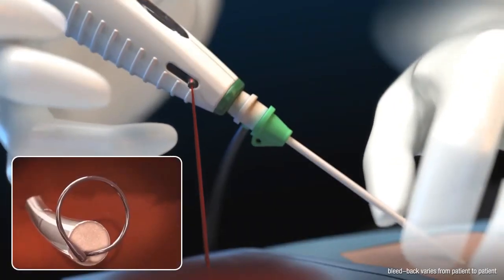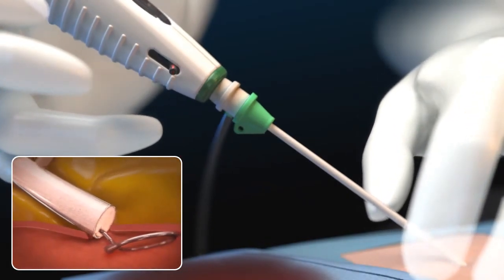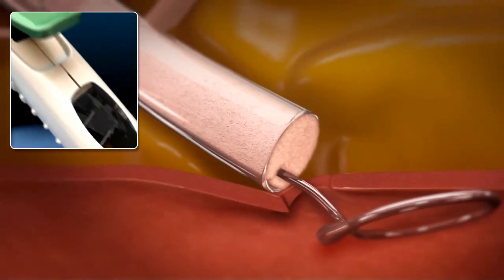Slowly retract the device and the vascular sheath introducer until pulsatile blood flow has significantly slowed or stopped from the bleed back indicator. When the window changes from black and white to solid black, depress the plug deployment button.